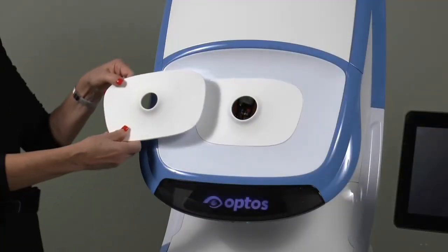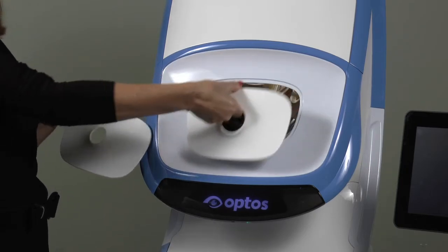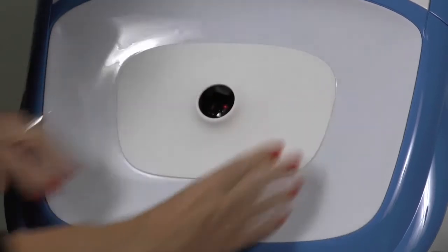If you have issues with lid and lash, you may choose to change the eyepiece. Each Daytona comes with a small and large eyepiece. To exchange, simply grasp between your thumb and index finger and gently pull to remove, then insert the other eyepiece and snap into place.